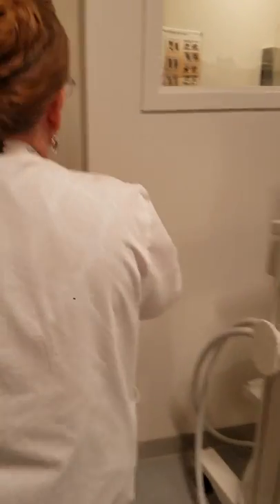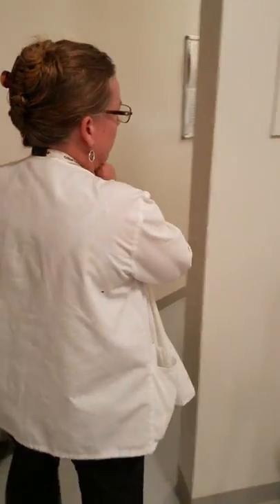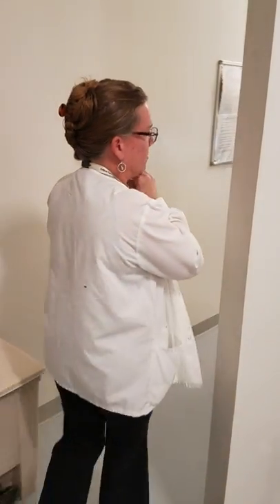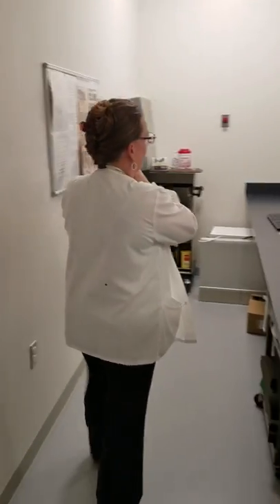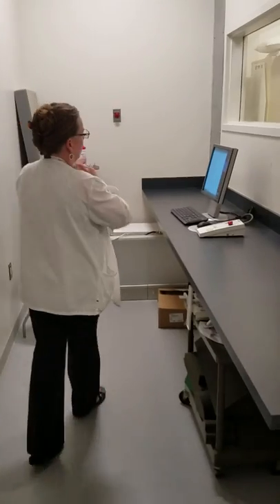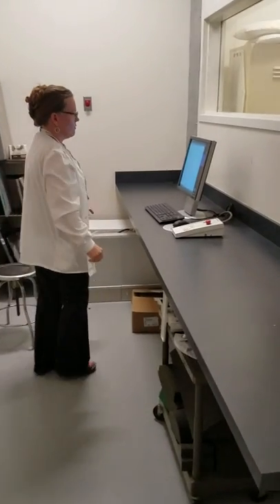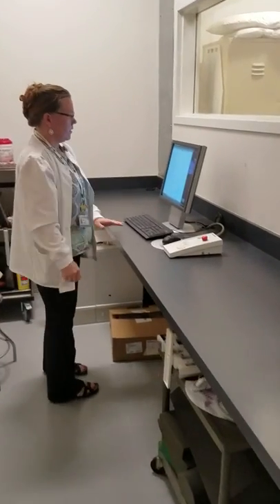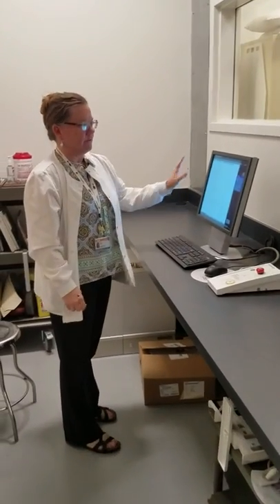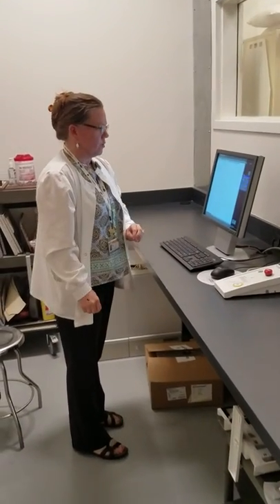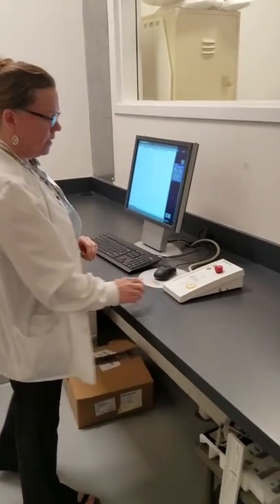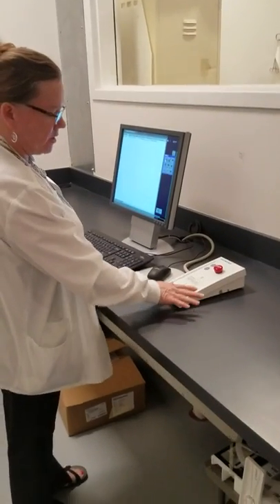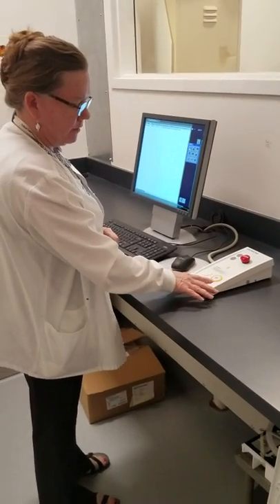Once we have positioned our patient for their exam, we come behind the control panel. These have changed over time — now we just have digital screens when you're working in a digital room. This button here is going to be our exposure button — it has a little x-ray tube icon on it.